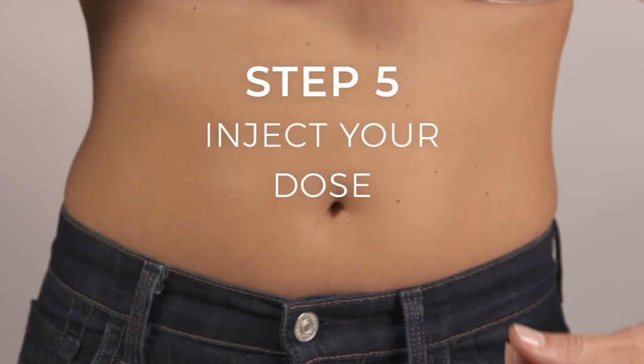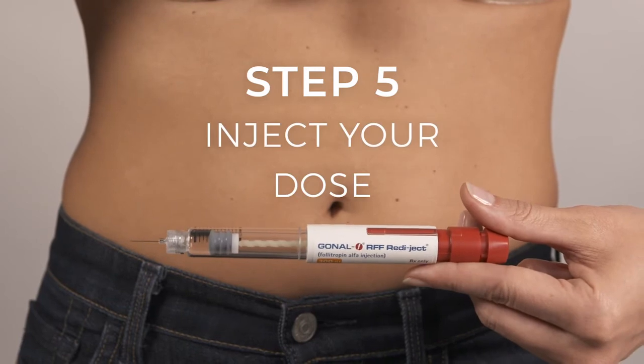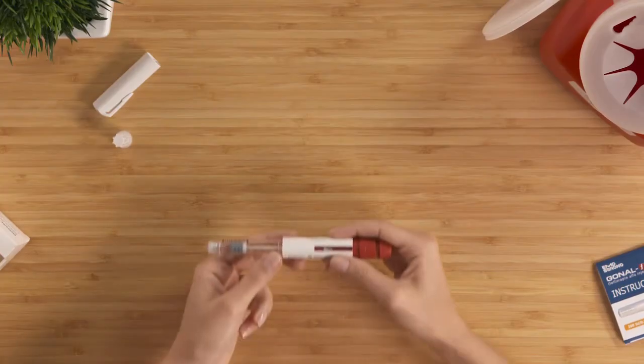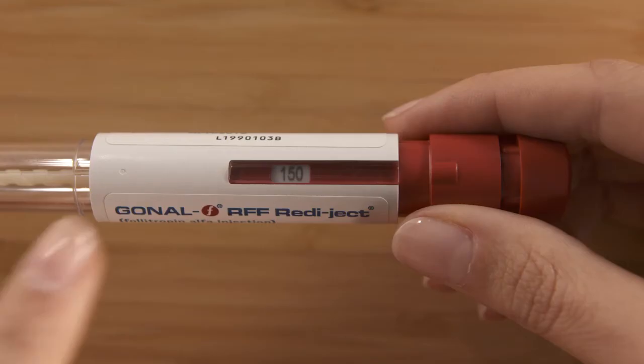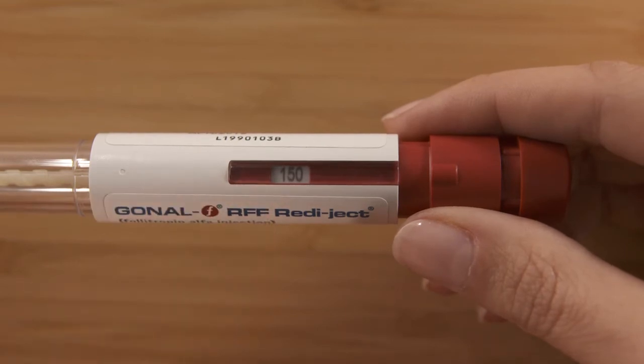It's now time to inject the dose. Let's do it. It's important to make sure the dose information display, this window on the pen, matches the intended dose.